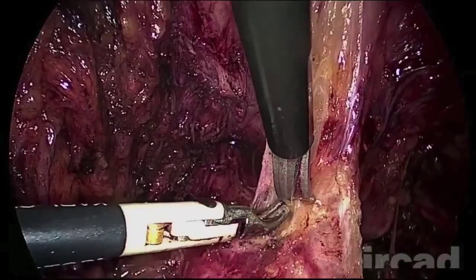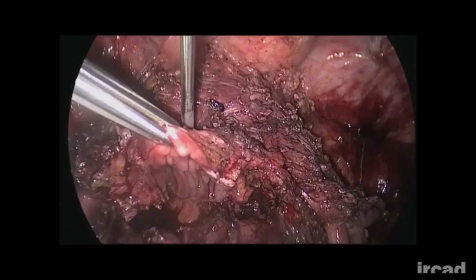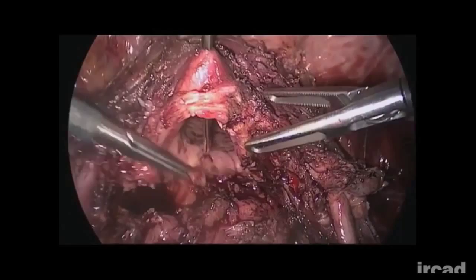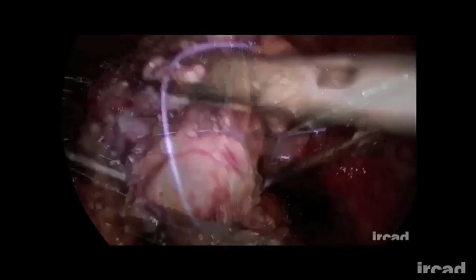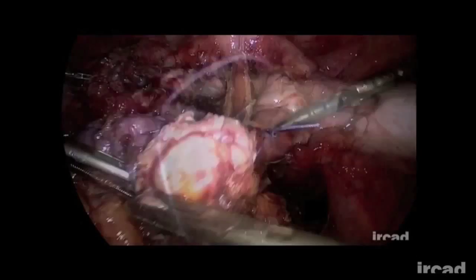The vagina can be temporarily closed using the T-Lift device, preventing carbon dioxide leakage during bowel resection. The device is then removed and the resected bowel can be extracted through the vagina. With the transanal bowel extraction technique, the T-Lift is used to keep the rectal stump open. The proximal segment of the bowel containing the lesion is closed with an endo loop and exteriorized through the open rectum.